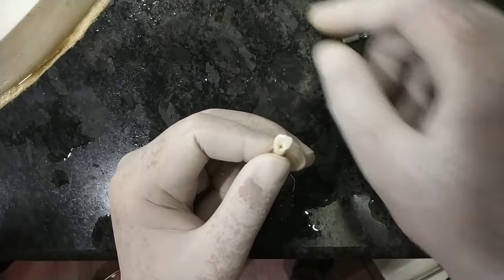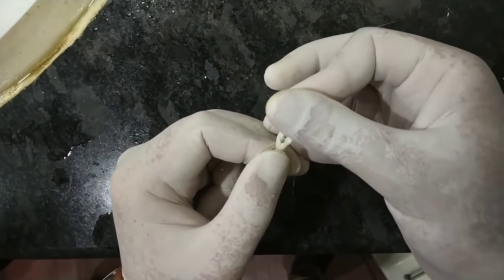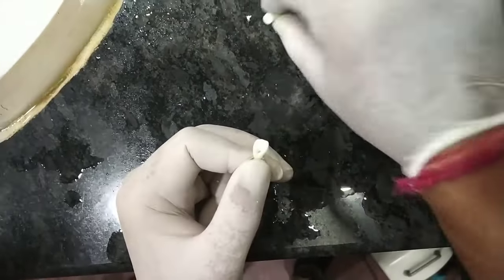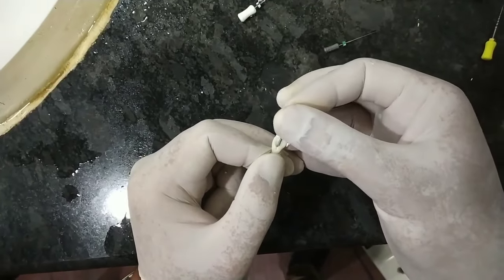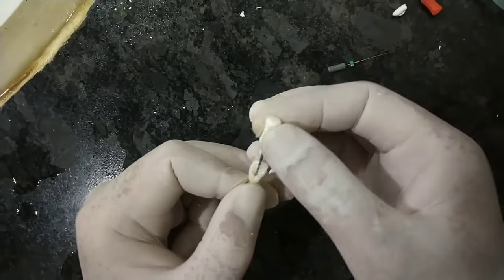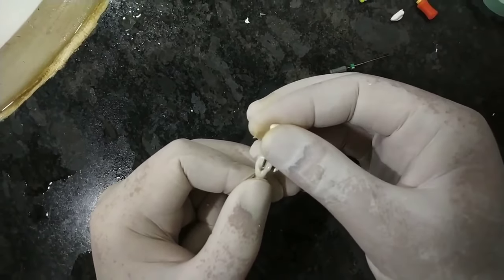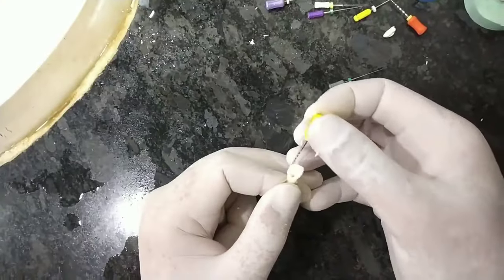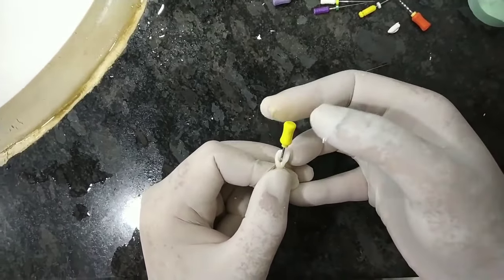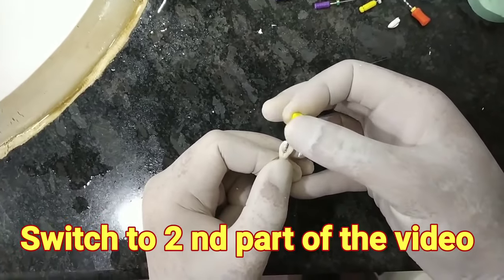Once you have achieved the straight line access, you first use the shaping file — insert S1 (the purple one). After S1, irrigate again, then use S2 (Shaping 2 file) with 3 to 4 quarter-turn motion. Then we use the finishing file — F1 file. You can enlarge till F1 or F2, which is the red color file.